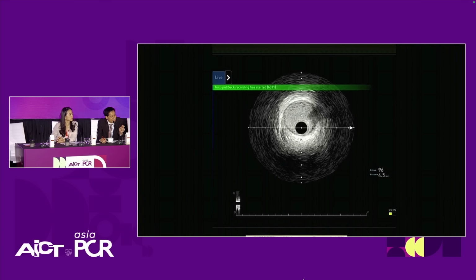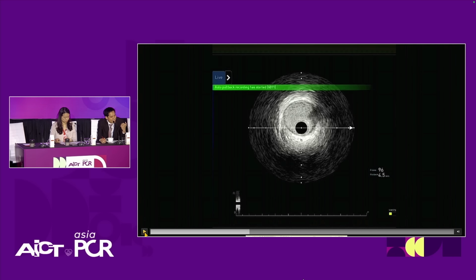I might use 2.0, but I will focus on the tightest one, not go all the way through. That is my approach. I think orbital you can do it, but I still like rota because it is faster.